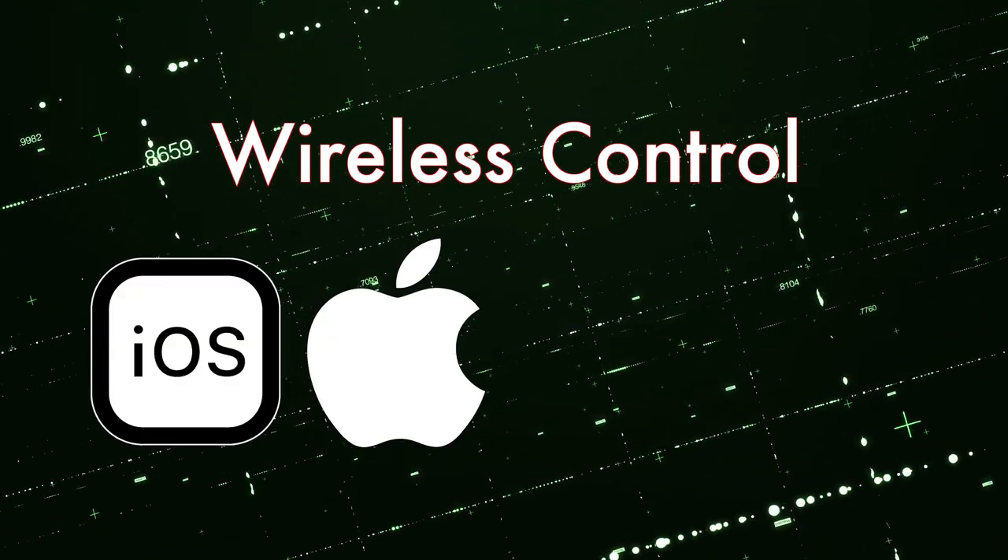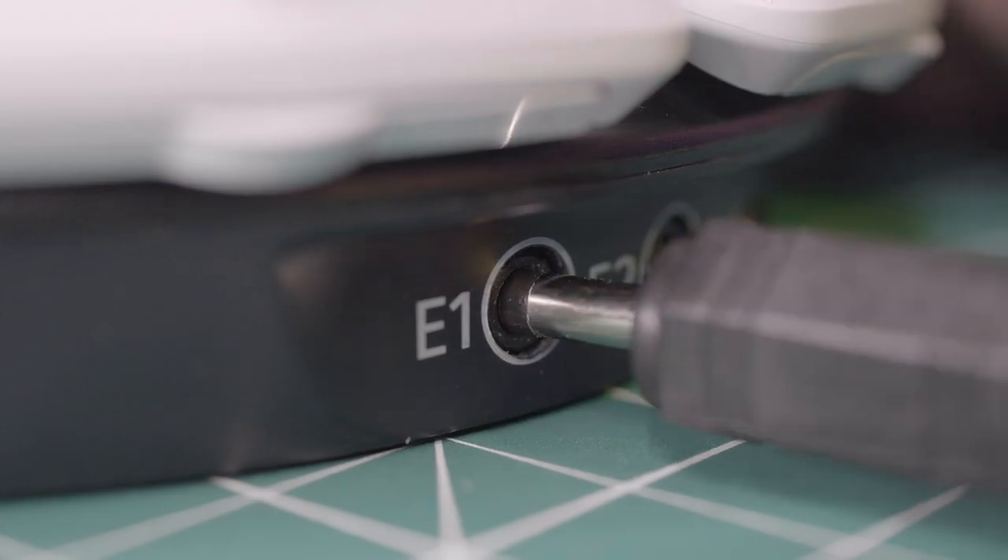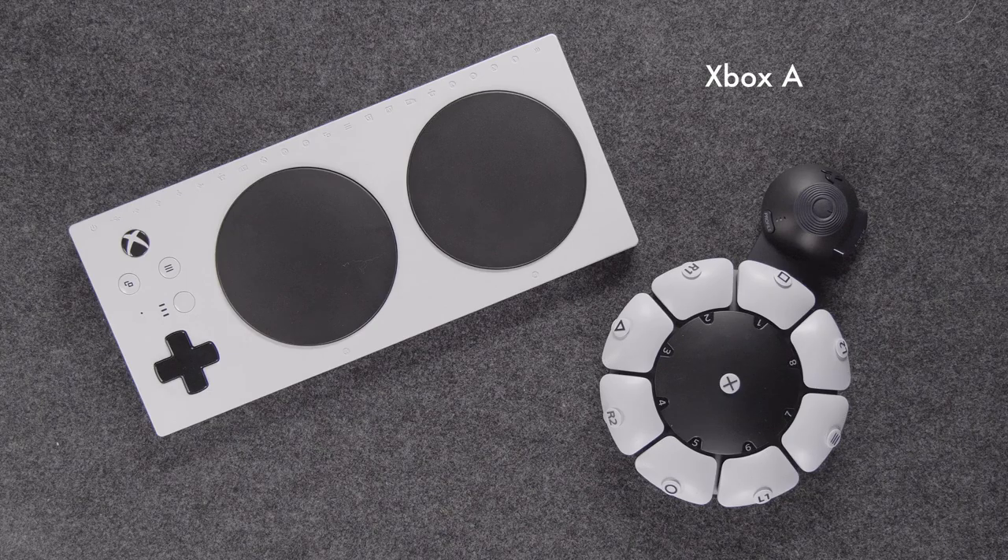Connect the Byte Switch with the Airturn Digit for wireless control of iOS, Mac, Android, or Windows devices. The Byte Switch plugs directly into accessibility game controllers, such as the Xbox Adaptive Controller and the Sony Access Controller.